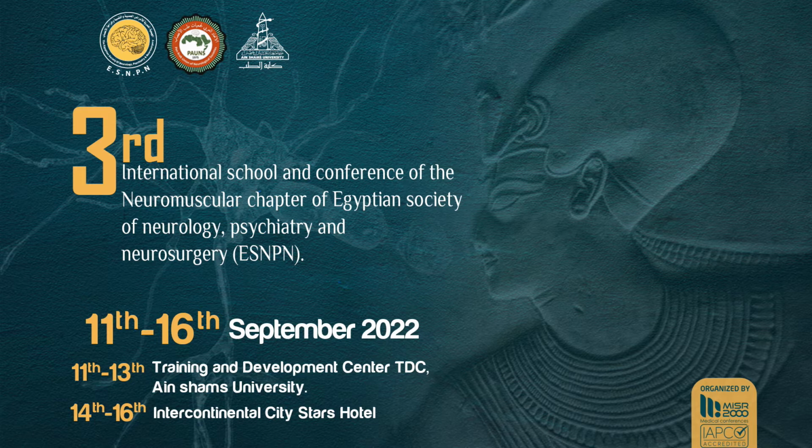What's the time? 3:19. I can show you if you want to see. I think it's going to be very exhausting. If you guys want to see H-reflexes, I can show you H-reflexes. I can show you some other things. It's your call. I'm here. If anybody is interested in any other nerve or whatever, I'm happy to show you.